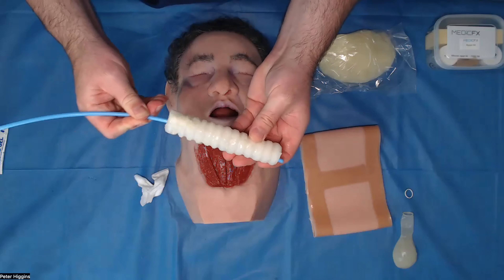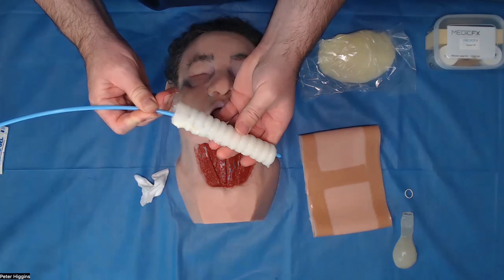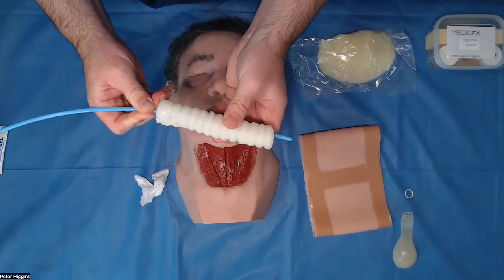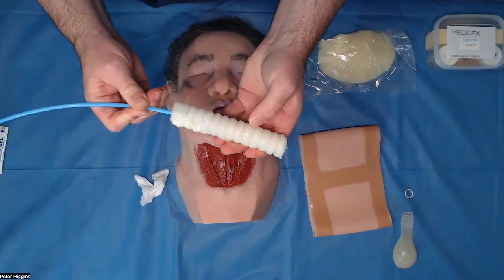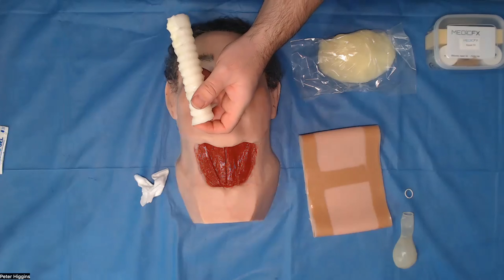As I said before, this will just prevent the tube from hanging up on the inside of the trachea as you're trying to advance, as well as your participants are trying to advance the tube later once they've made their incision. So there we are, the inside of the trachea is nice and lubricated now.